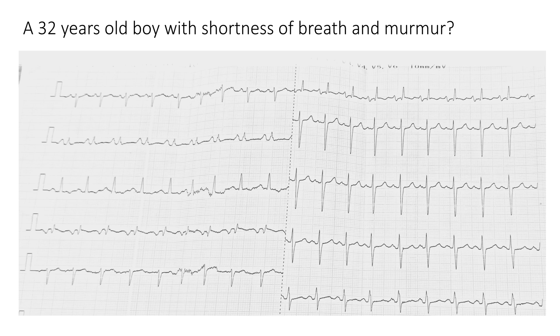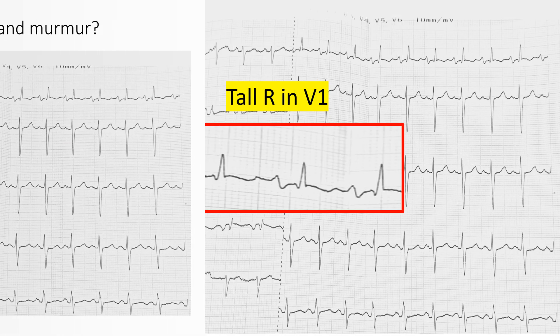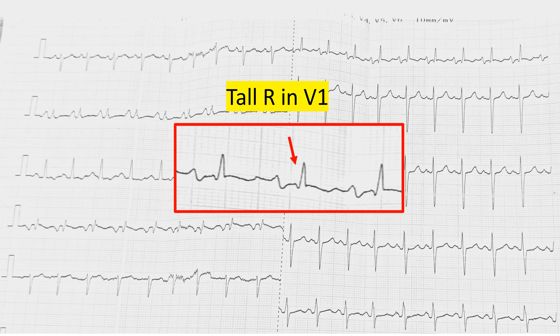Starting with the most obvious finding: in the chest leads V1 and V2, there is a tall R wave in V1. Usually the R wave is not that tall in V1. There are some causes, both physiological and pathological, so we need to look at other findings to determine if this is a pathology.